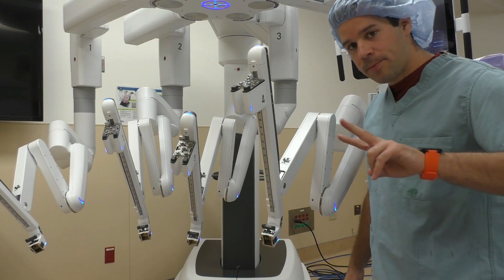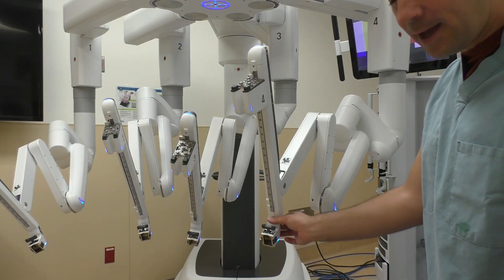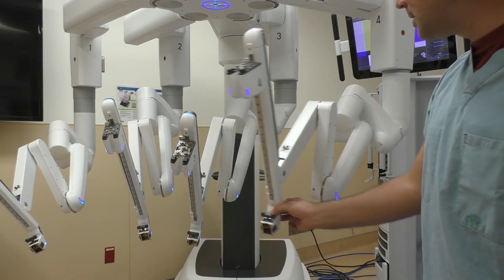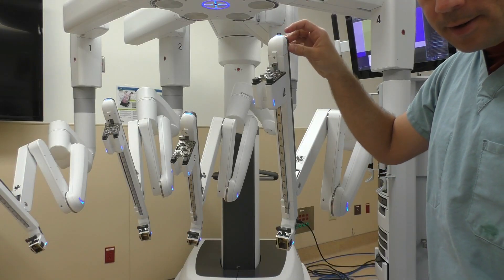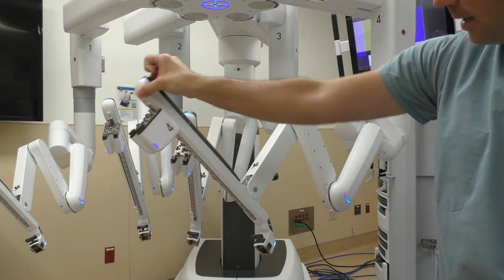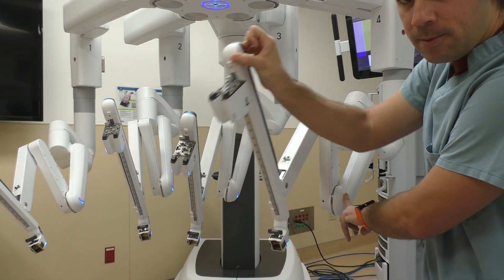We have two more buttons attached to each of these arms. There's one button at the bottom — the hand, I like to say — and that's going to move the arm side to side, up and down. And there's a button up here that's going to angle it left, right, forward, and backward.